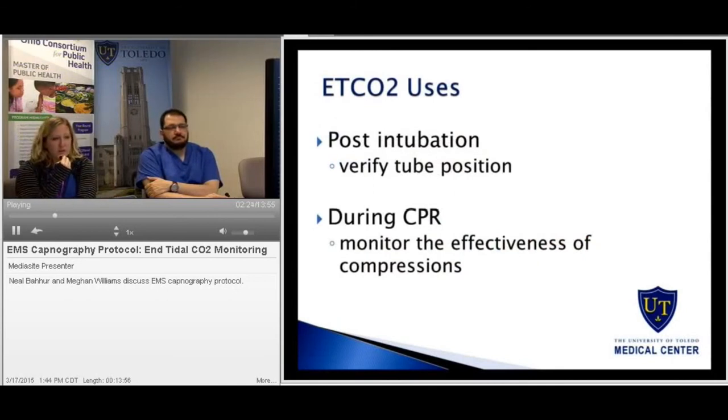There's a couple different uses of end-tidal CO2 monitoring. The most important ones that we typically use it for are the post-intubation period. You can verify that the tube is in the right position, and if the tube is not in the right position, it gives you a heads up so you can put it back into the right position. We also use it during CPR. You can monitor how effective your compressions are, make sure the depth and the rates and everything are adequate for resuscitation.